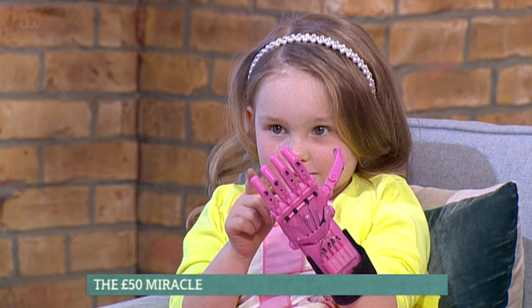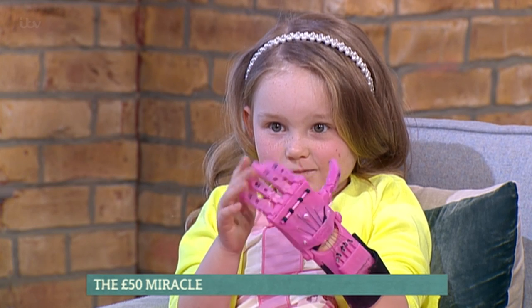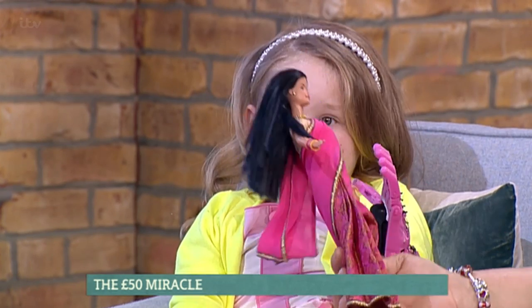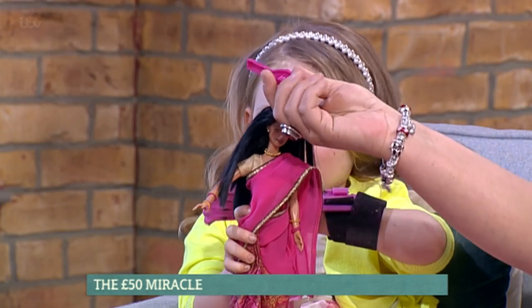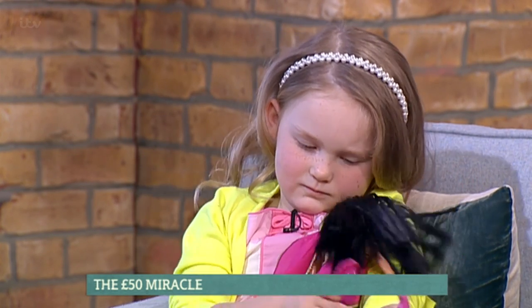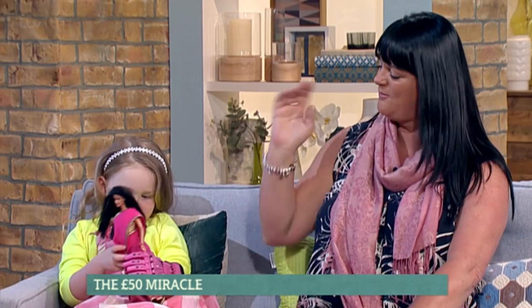What can you do with it, how does it work, how much can you move it? You can move it a lot — which means you can stroke your doll's hair, which you haven't been able to do before, and you can brush your doll's hair. And the cost of the hand to print is anything from 50 pounds. It's so cheap.